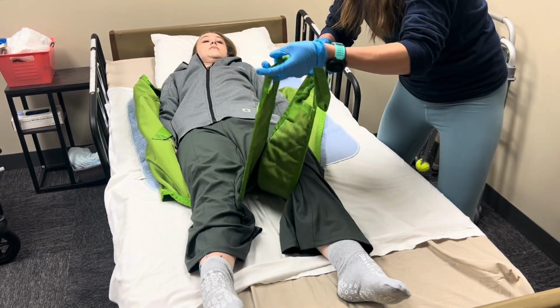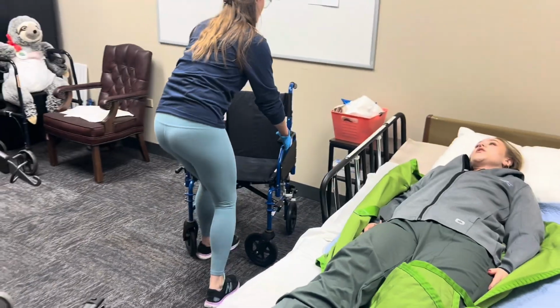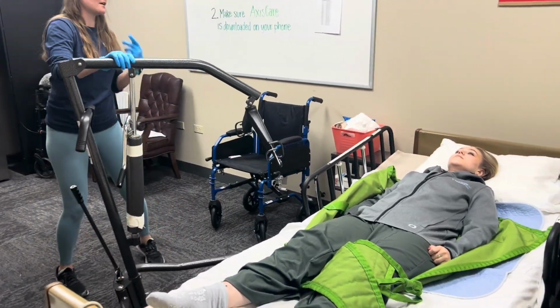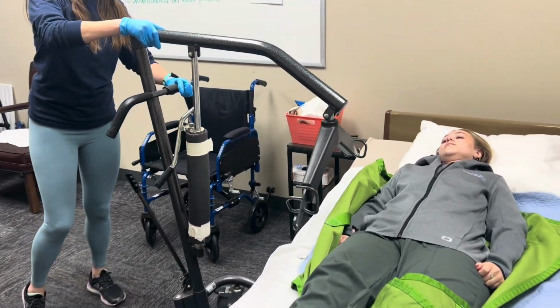And they get crossed onto the other side, opposite side. You'll understand more when I get the Hoyer sling. So, are you comfortable, Michaela? Okay, perfect. We'll get everything ready. So, here's our Hoyer lift. I'm going to drop the bed rail, and I'm going to get this Hoyer over to you.